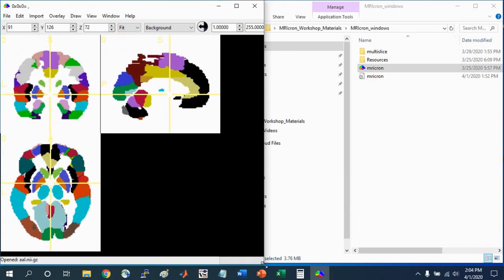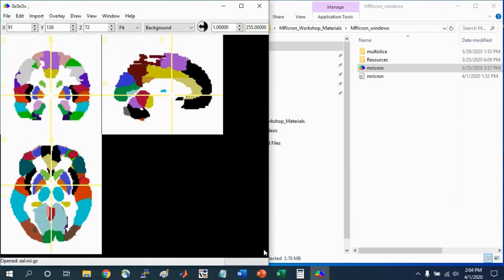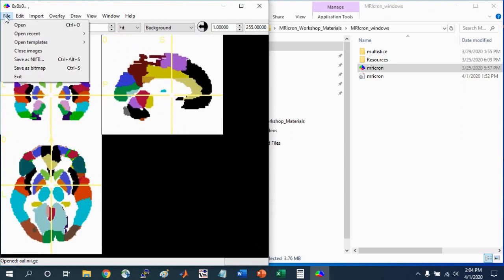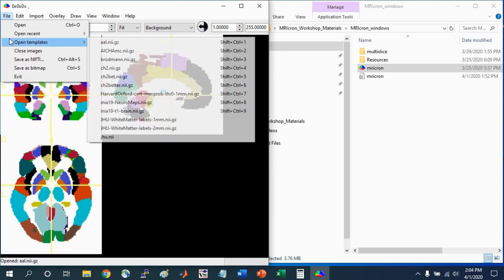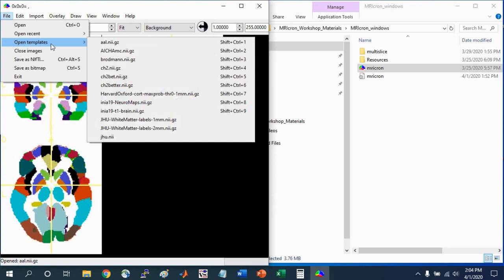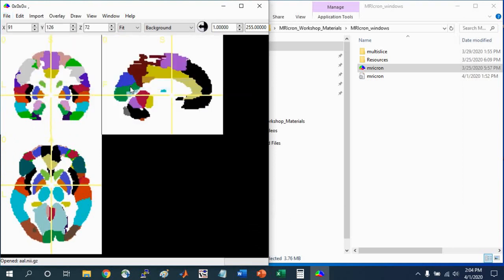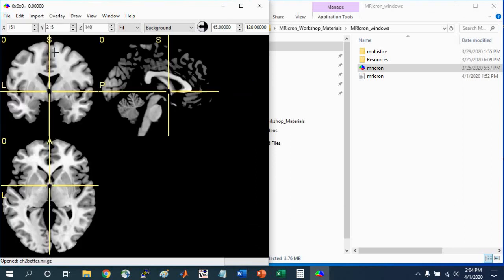it opens up the image that I had loaded when I closed it. I'm going to start out by opening a standard brain. Go to File, Open Templates, and I'm going to use the CH2BetterBrain, which is a good standard MNI space brain for us to work with.